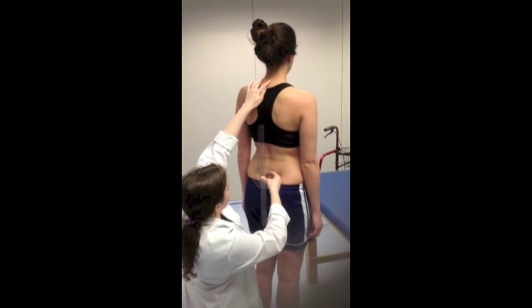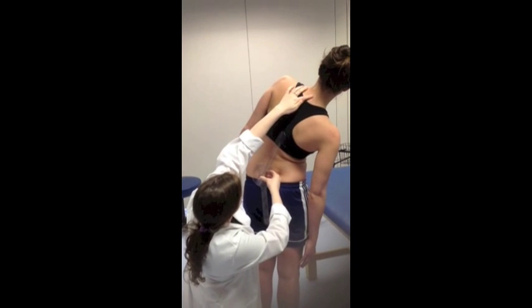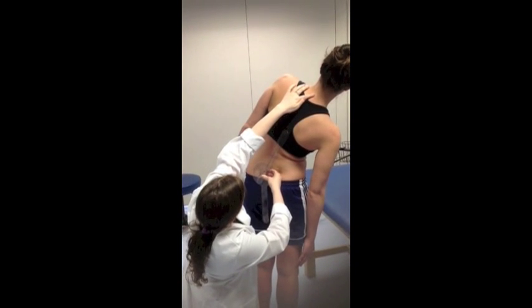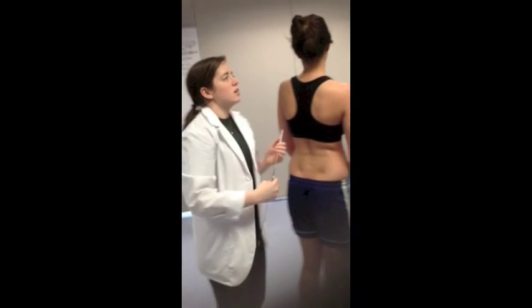Whenever you're ready, you can bend to your right. Perfect. And come on back up. That was 30 degrees. So if we were doing the left side, we would just have her bend the other way, and we would measure it the exact same way.